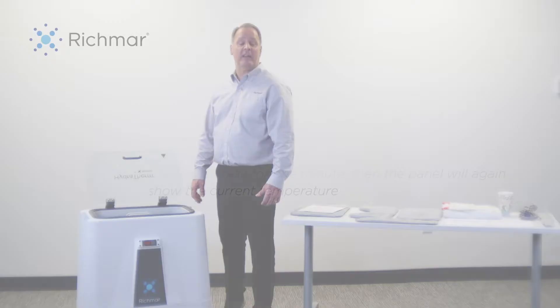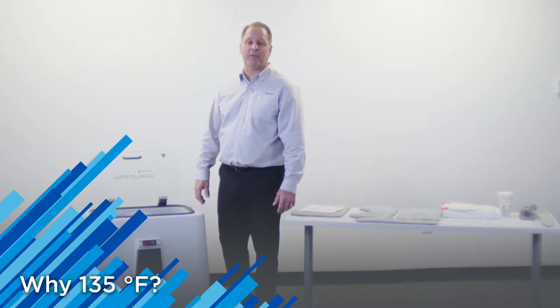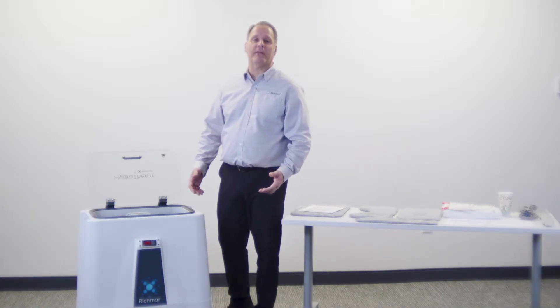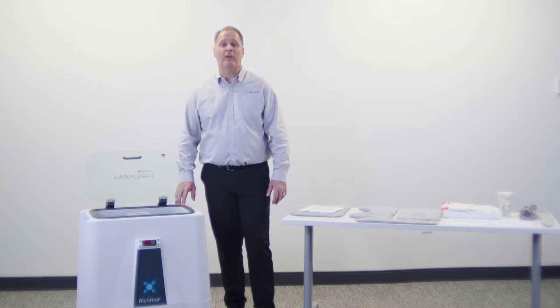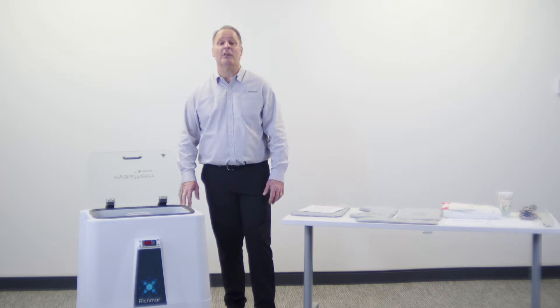Often when I go in to in-service clinics on our device, I'm often asked the question about temperature. Everybody always asks why 135 degrees? Conventional moist heat therapy devices use the temperature of 160 degrees, and that's what is in their manual. There's nothing therapeutic about 160 degrees, and that's what everybody else in the moist heat delivery systems uses.